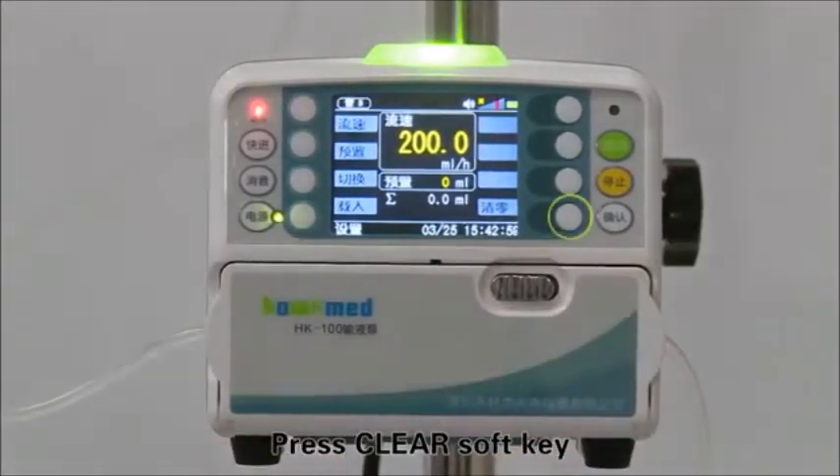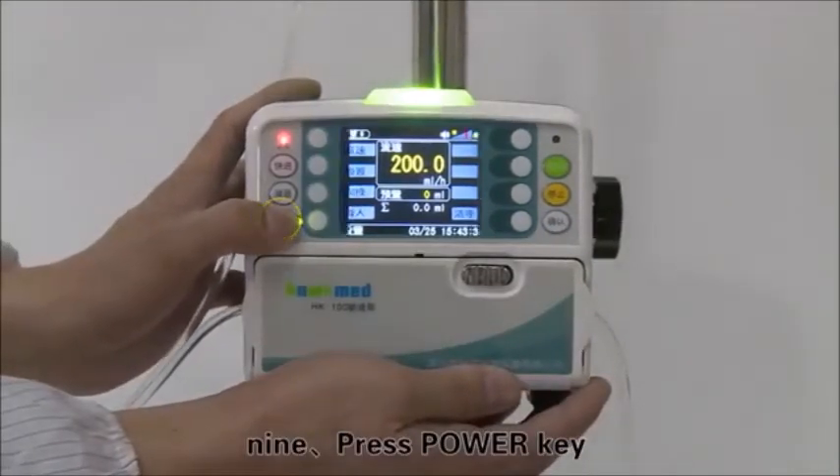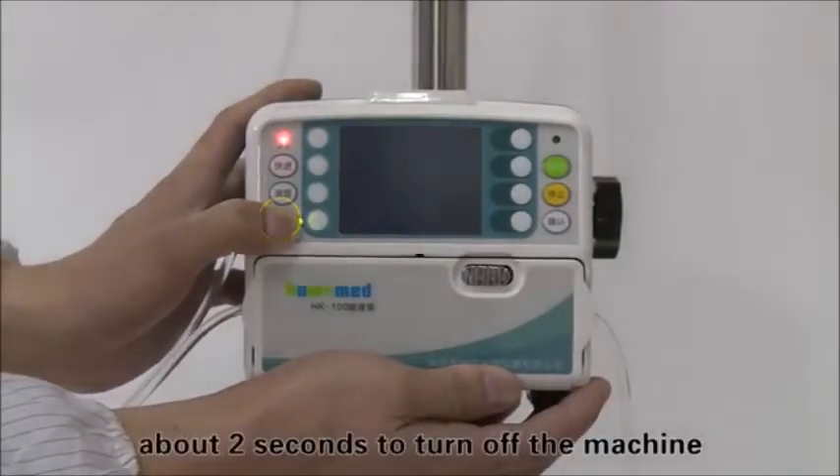Press the clear soft key to clear the accumulated volume. Press the power key for about 2 seconds to turn off the machine.